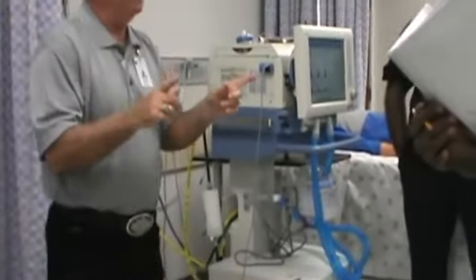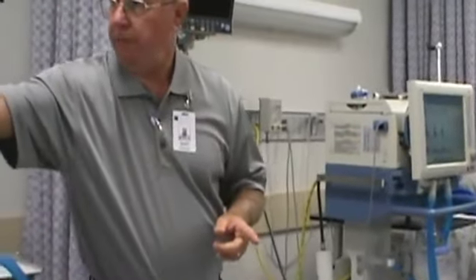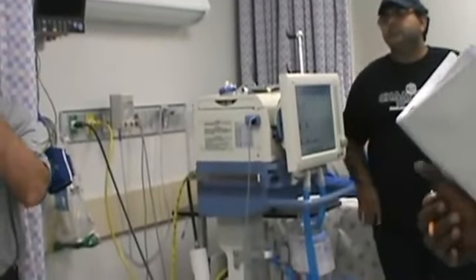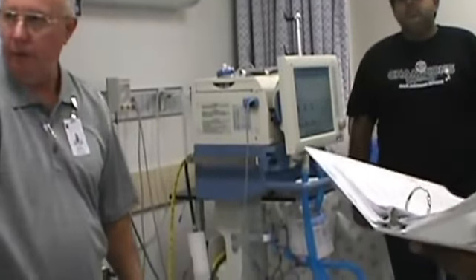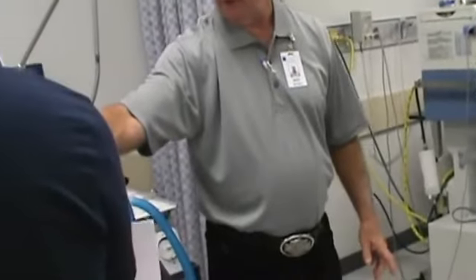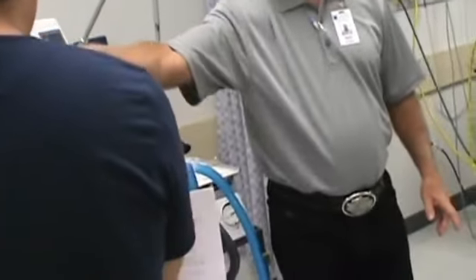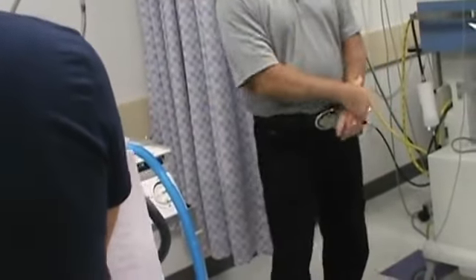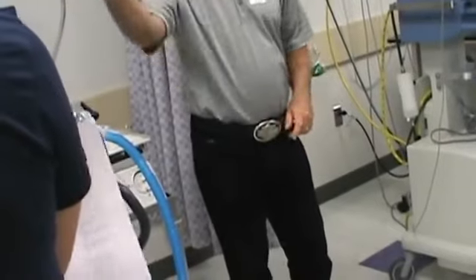Well, before you turn that nebulizer on, look at your peak pressure. All right, now I'm at 15. So if I turn the 8 liters on to nebulize the medication, then I need to come back over here and see how high that goes up. And I drop my tidal volume down to the point where I go back to the peak pressure before I turn that 8 liter flow on. That's your guideline, peak pressure.